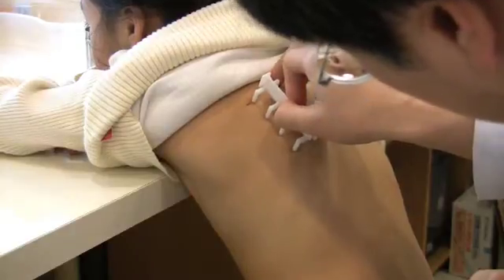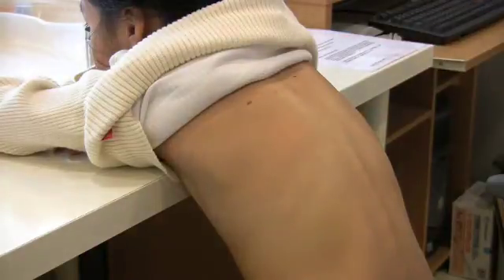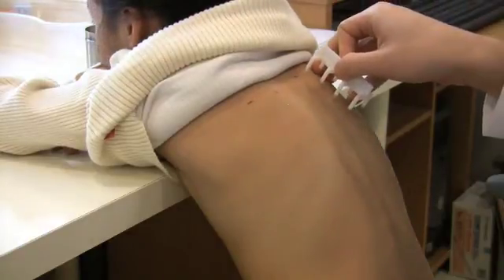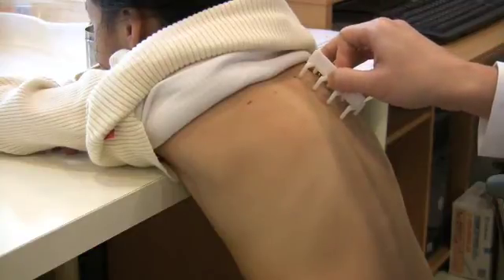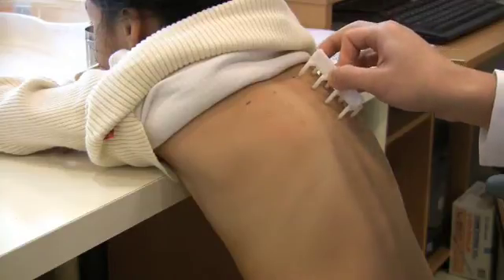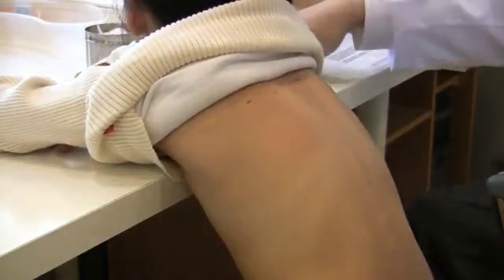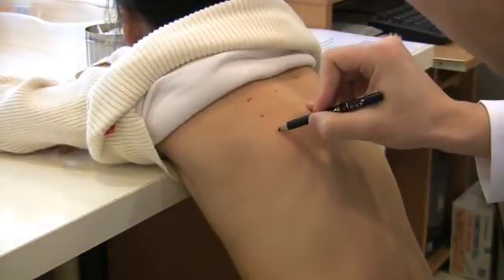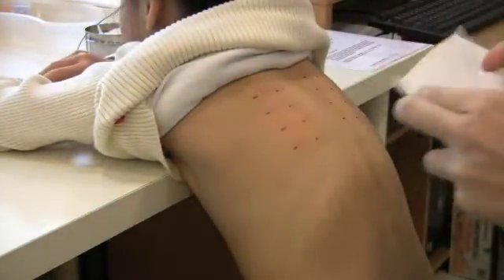It is important to apply even pressure over the eight prongs. There will be a slight prickling sensation during the application of the device. This procedure is usually well tolerated even by young children. The positions are then marked and the excess extract removed by blotting.